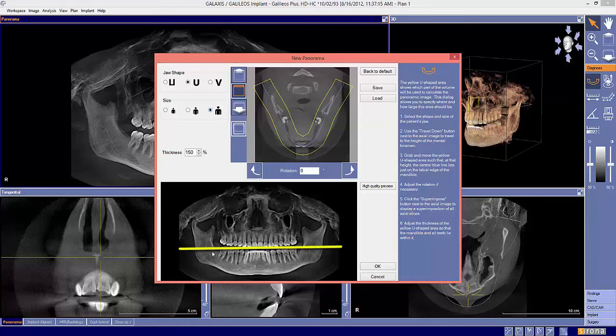Currently, we see it here in the lower window, and I want you to move it down to intersect with the mental foramen here.